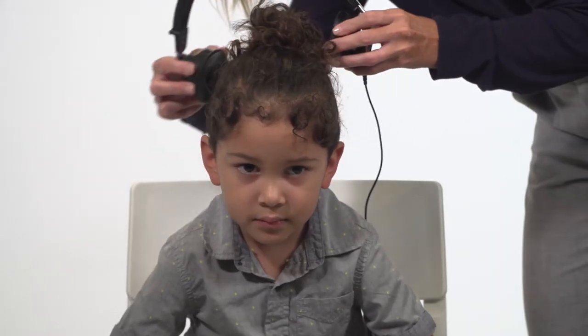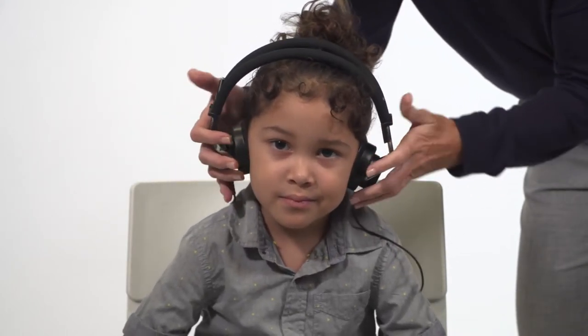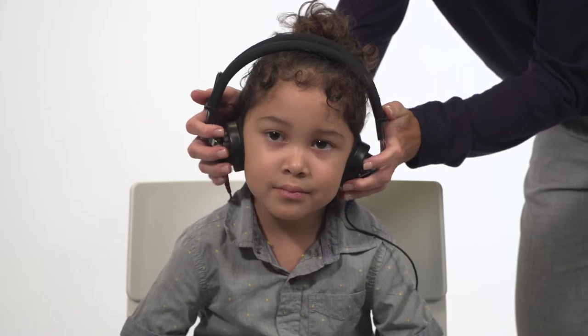Place the headphones directly over the child's ears with the red phone on the right ear and the blue on the left. Remove any obstructions that may interfere or be uncomfortable, such as glasses. Adjust the headband so the headphones are centered over the ear canal.